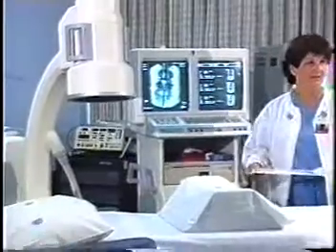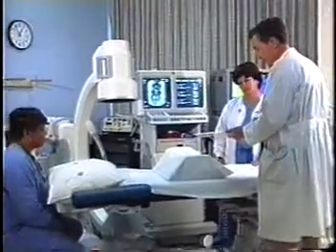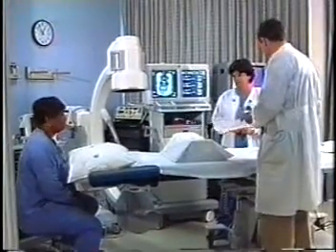The extremely small size of the fiberscope and catheter allows the gathering of reliable information with minimal risk and discomfort to the patient. The procedure is performed in an outpatient hospital, clinic setting, or freestanding surgery center. The most common reasons for performing spinal endoscopy include the treatment of back or leg pain caused by inflammation or compression of a spinal nerve due to vertebral disc injury, postoperative scarring from prior back surgeries, and narrowing of the spinal canal. Spinal endoscopy can also diagnose scarring or inflammation around a spinal nerve when other tests are inconclusive, as well as enable the physician to directly observe the inside of the spinal canal and inject medications to the targeted site of pain.